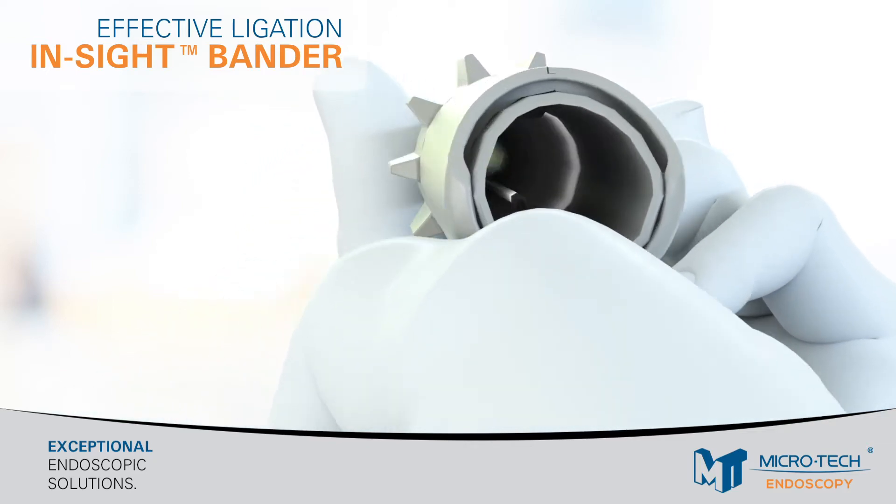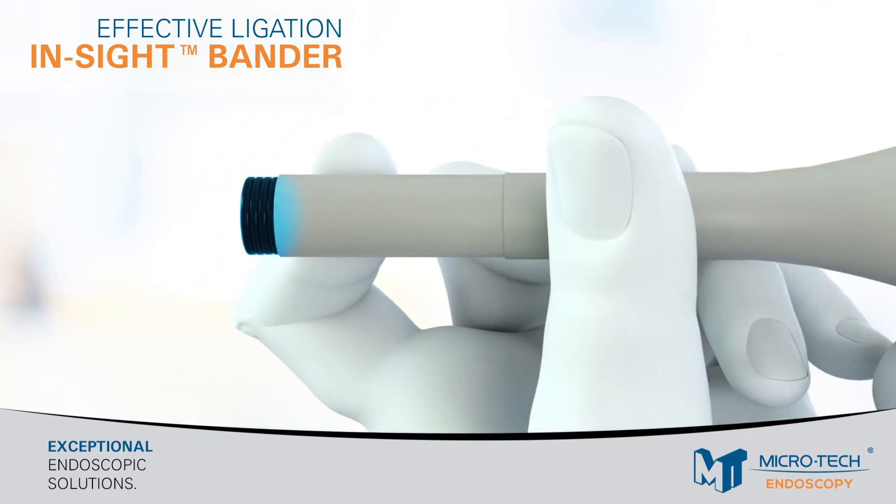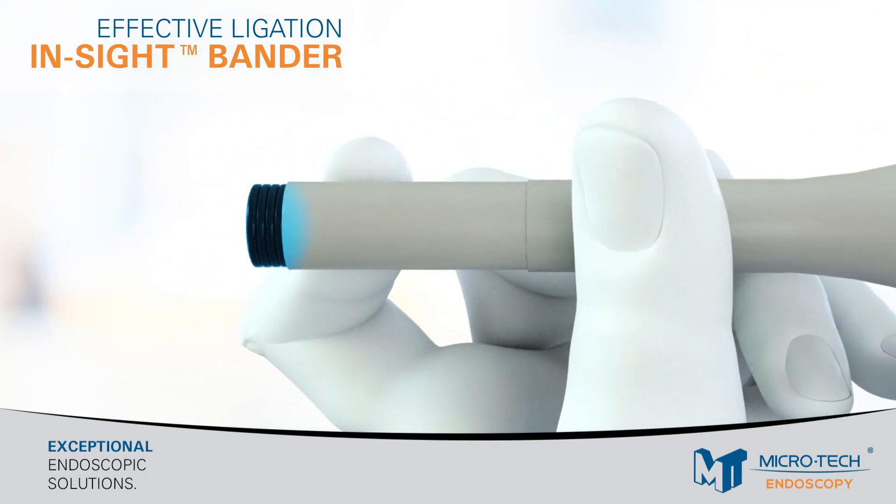This is important because ligation bands must be properly placed about 10 mm above the dentate line. The anal canal can vary from 2 to 5 cm depending on the patient, therefore making direct visualization essential in banding the proper area.